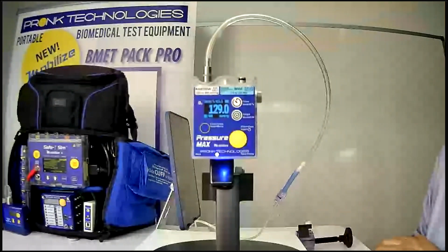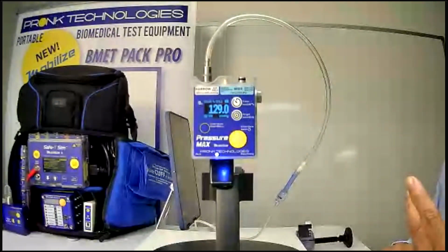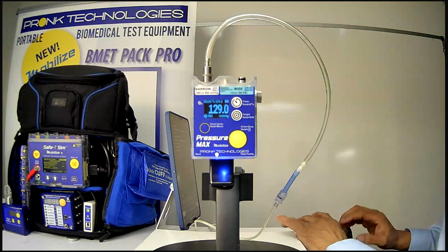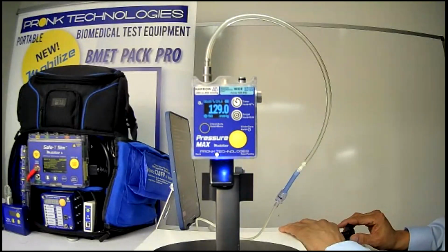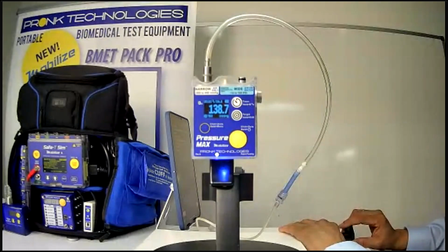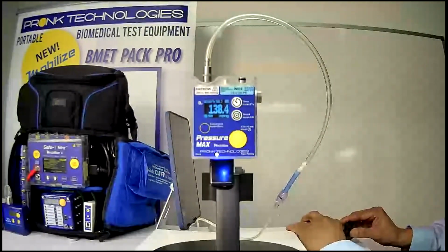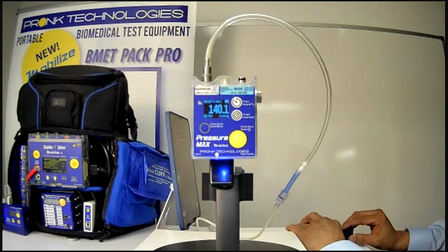That's my target for a particular target setting I had created, and it's in millimeters of mercury. So what that really allows me to do is, as I'm inflating the medical device and I'm trying to confirm I've reached that target, the unit will illuminate blue while you're below the target pressure that you programmed. But once I get within the tolerance that I programmed, and in my case, I programmed it so that it needed to be within 1 millimeter of mercury, when I get to that pressure target, the unit will turn green.